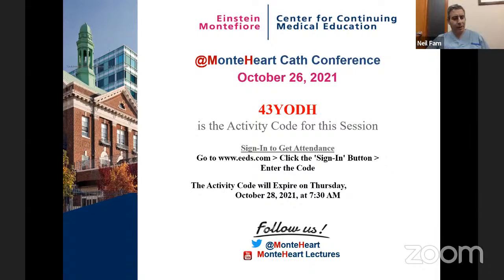Yeah, so we published on the difference between XT and NT, and I was an early proponent of XT, as were many in Europe. It just leads to better TR reduction, but of course the XT can be a weapon in the tricuspid valve, with very thin leaflets or severe tethering.